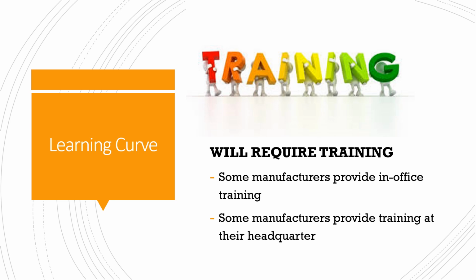But we want to make sure everybody in the office, dental assistant, dental hygienist, dentist, those are the three that can take an intraoral scan, is properly trained. Now, some companies will come to the office and train the staff, or some companies require that you go to a set place where the manufacturer is in order to provide training.